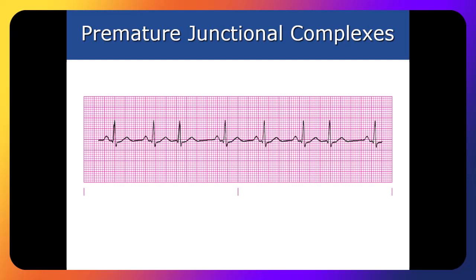All right. Does everybody understand why that's a PAC? I'm sorry, PJC. Thank you. So if there was a P wave in that spot right there, that would be considered a PAC. It depends. If it's an upright P wave, that's a PAC. If it's an inverted PAC or inverted PJ, I'm having a stroke today, folks. Thank you. Yes, it would be a PJC. Yes. Now, do you see any more in there?